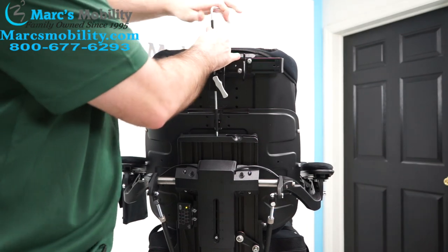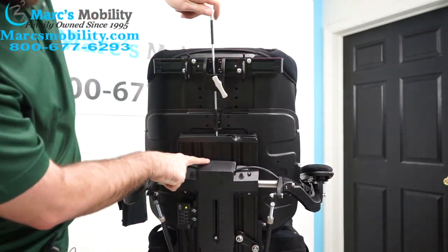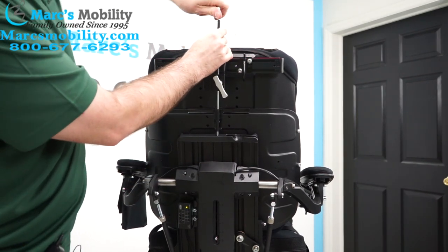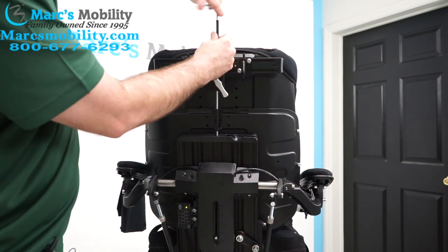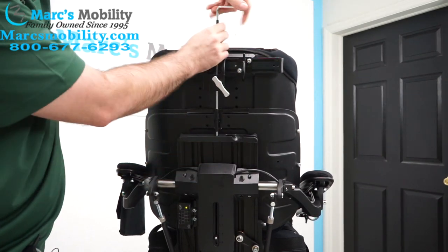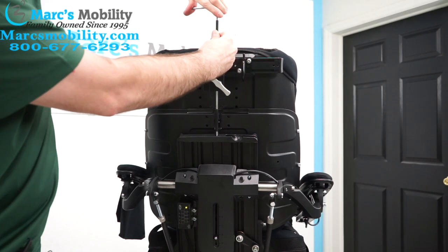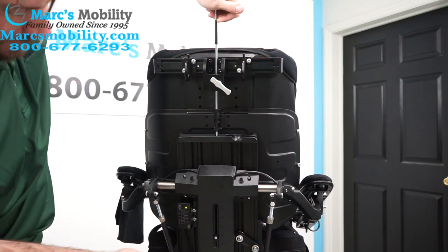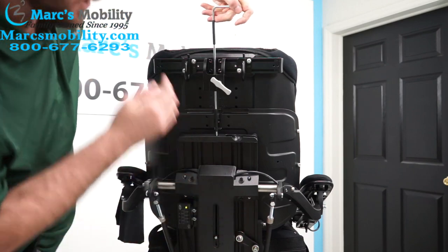Turning it left will bring your arms down, going right will raise your arm. You'll see this whole thing is going to start to drop. You'll notice while you're doing this, your actual arms will start tilting down — that will be fixed in a second. Once we get the height desirable, you might have to go back and forth between the two to get a nice fit. I dropped it about an inch right now, but it can go all the way down to basically this track right here. You can get them pretty low.